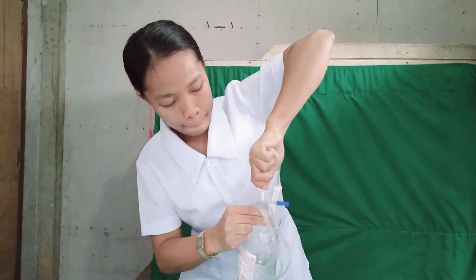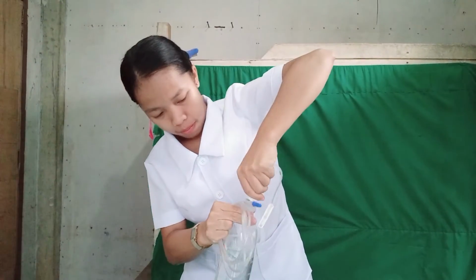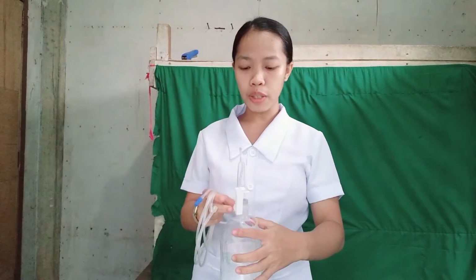Make sure that we place our fluid on a flat surface, and in inserting, we could turn it and push it and turn it side by side to maneuver. Okay, now we're done inserting. We will now suspend our IV solution and hook it onto the IV pole.